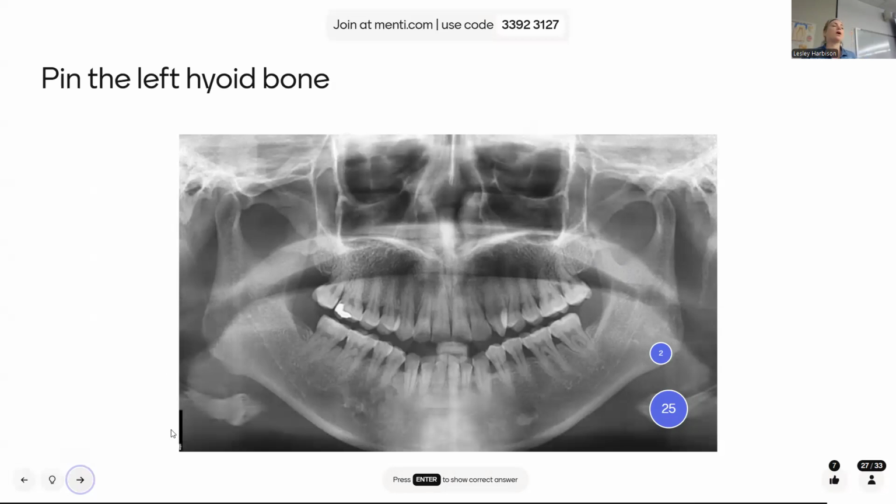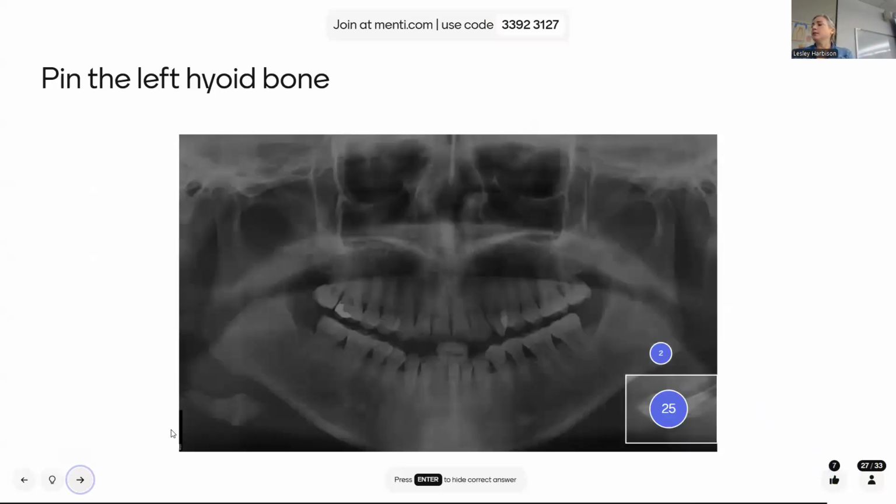Nasopharyngeal, oropharyngeal, and palatoglossal. Palatoglossal, though, is officially like an airspace, but it's still an airspace. But the nasopharyngeal and the oropharyngeal are always there because those are just your throat. Palatoglossal is when they don't put their tongue up, because that's palate and tongue, palatoglossal. Yeah. Okay. So, yeah, hyoid bone.